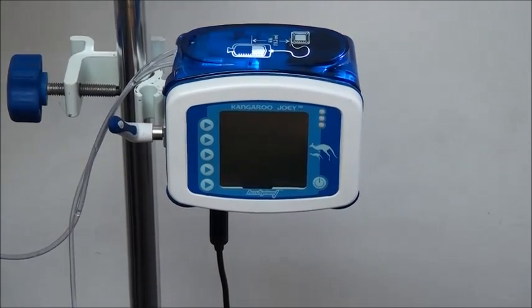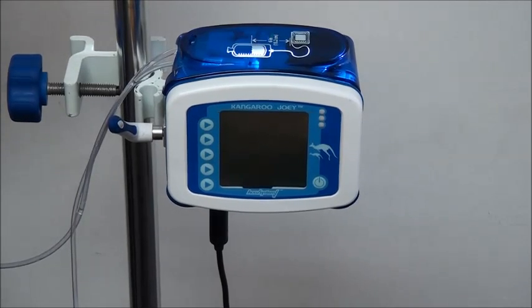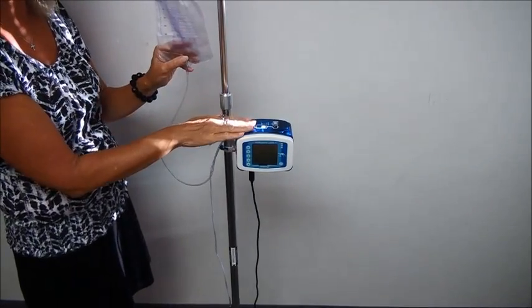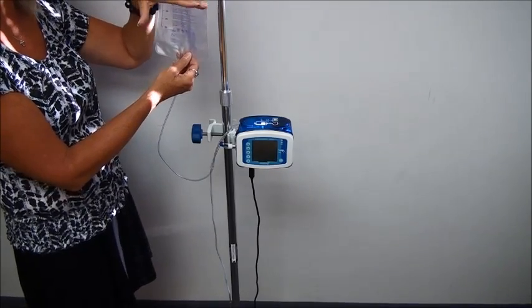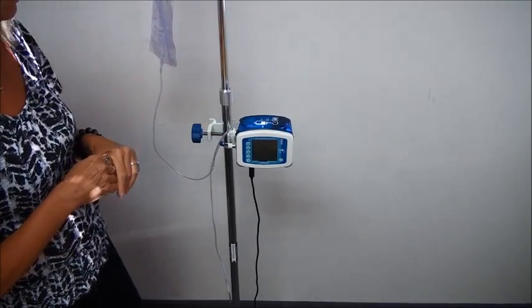Another important thing is how high you hang the bag above the pump. You want to make sure that once you pour your food into the bag, your food level is going to be 6 inches above the top of the pump. So what I mean by that is when you pour the food in, the top of the food in the bag is going to be 6 inches above your pump.